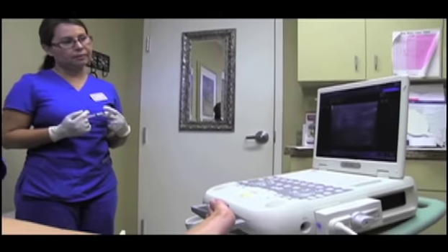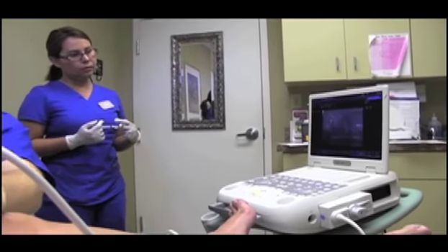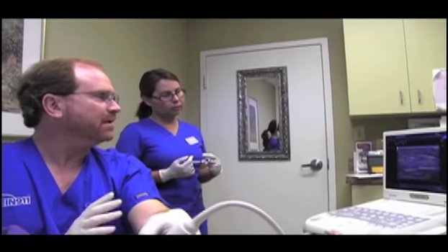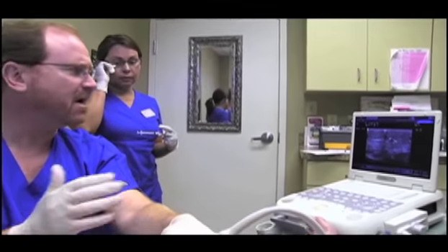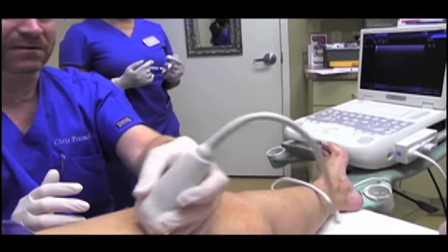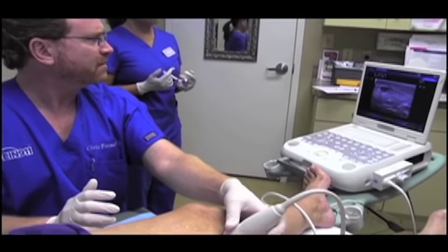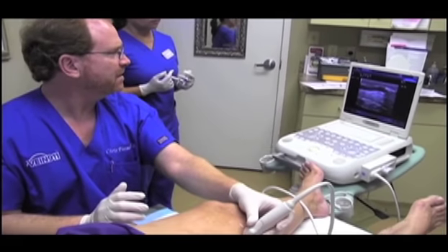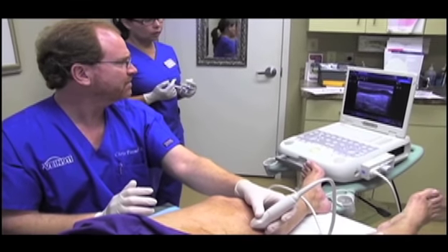Now that we've cut off those leaks above, the foam disperses in an excellent fashion. I injected very little — maybe one or two cc's — and we've gotten a lot of coverage of the veins here because they're no longer being fed by blood from above. Now I'm going to go find a segment that needs more foam. You can see just how ginormous these veins are.